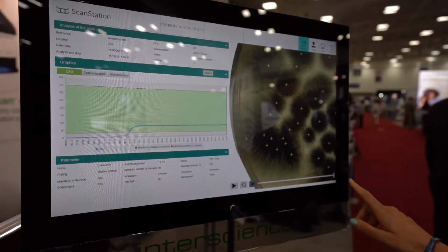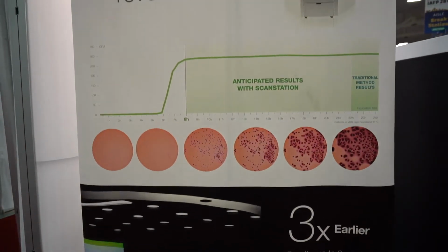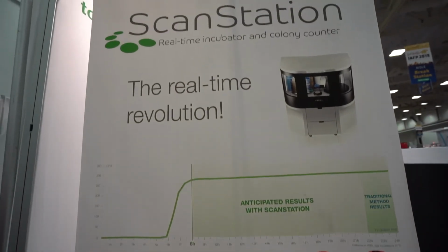So how do you define this kind of technology? Is it an alternative method? It's not really an alternative method, though it could be qualified as a rapid microbiology method, but we're still following the traditional method. We're still plating the sample on agar, but because you can follow the growth curve as it's happening, take coliforms: the SOP typically calls for 24 hours in the incubator, but we've observed that they grow between hour 8 and hour 10. So if at hour 12 you see that you've plateaued for 2 hours, you're already free to do whatever you want with those results. You can leave them in the incubator for up to 24 hours, but you have the results really at hour 10.